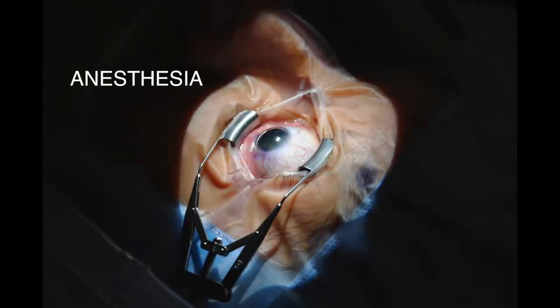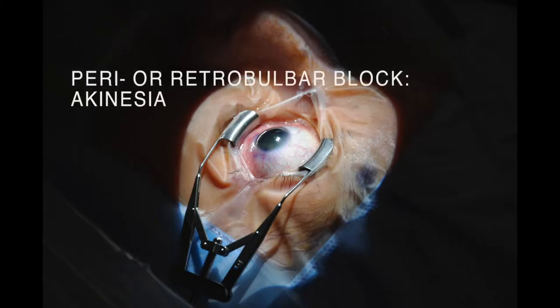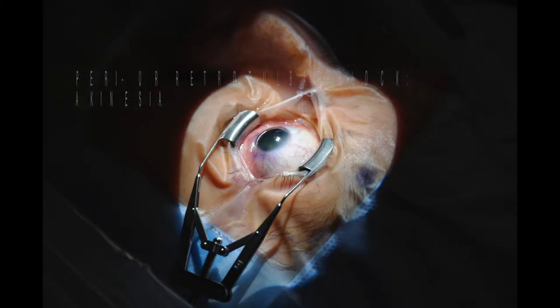Although angle surgery can be performed with topical anesthesia, it is not unreasonable initially to administer a local block to achieve akinesia in order to build surgical confidence and avoid intraocular complications.